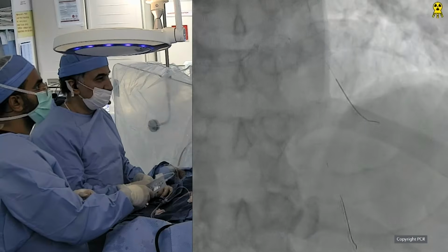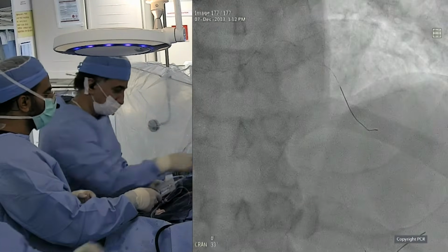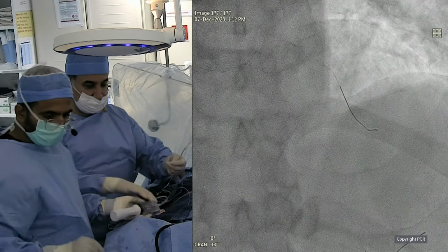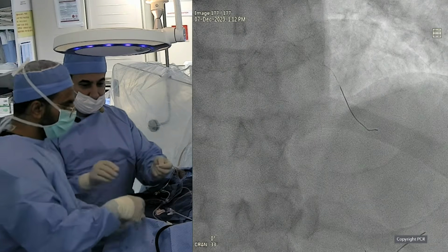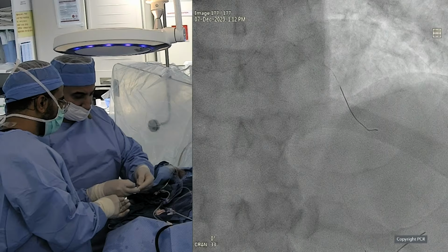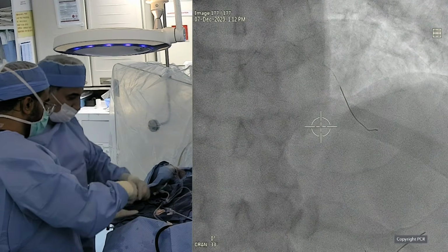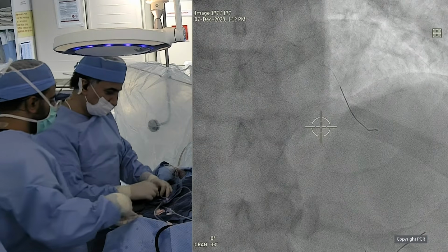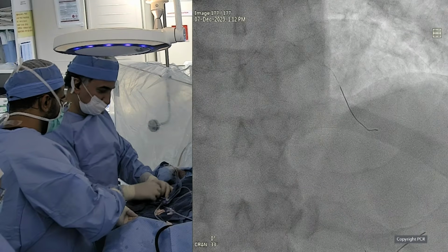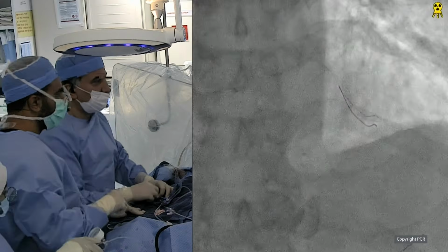And we can figure out, when we are dictating the rules for calcium, which type of device to use based upon the calcium. In fact, they used a simple 2.5 balloon, and they made a lot of cracks. We are still learning about the connection between type of calcium and how to prepare the lesion. But we always knew that if we use balloon angioplasty in tight lesions, it's going to crack the whole surface. It has to, otherwise it doesn't work, really.